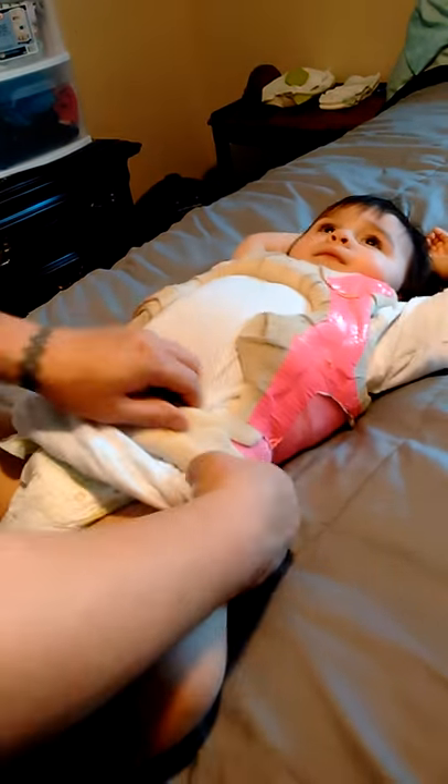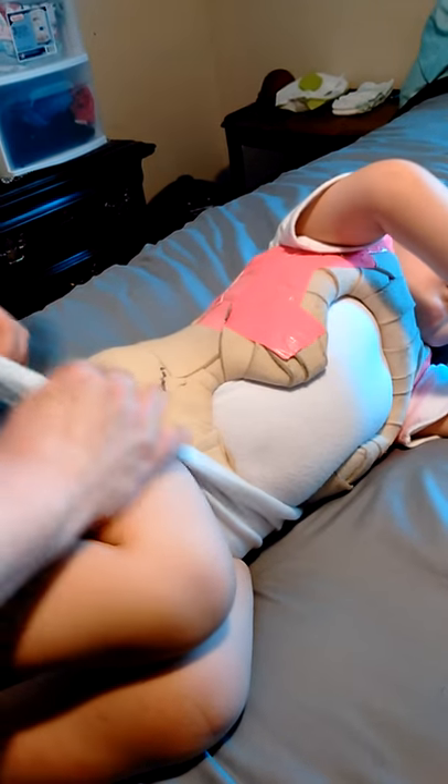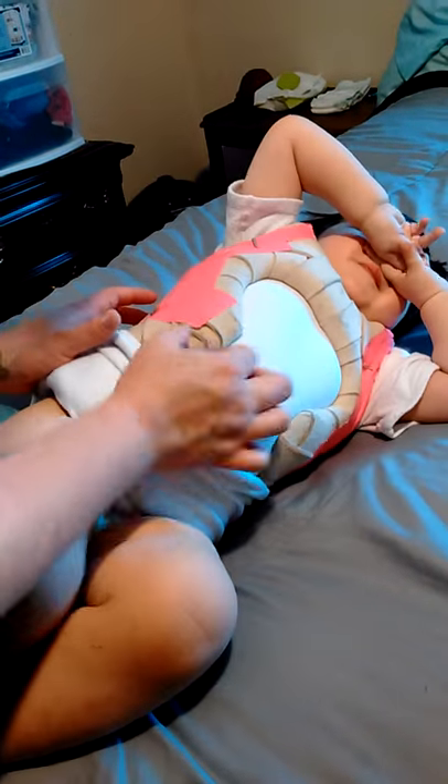That's pretty much what you do from there — just get it to snake around without pulling too much of the shirt underneath, just a little bit. You might have to roll it up a ways. All right, you didn't even have to take the diaper off. Then pull it down snug.